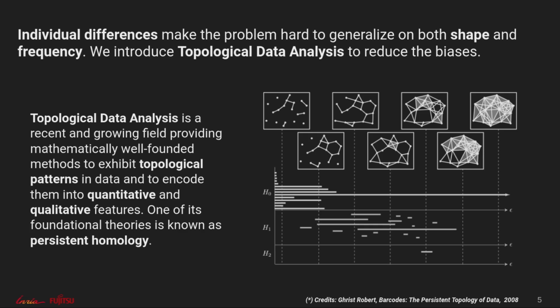So take a 2D point cloud. Create a circle around all of those points given as centers and give them a radius that they all share. Grow the circles synchronously. As soon as the circles intercept one another, then you have created what you call a connected component. This event will be recorded as the birth radius of the created component.